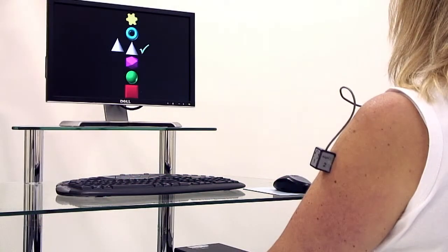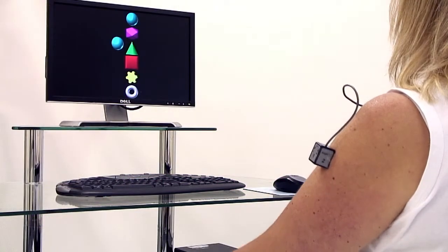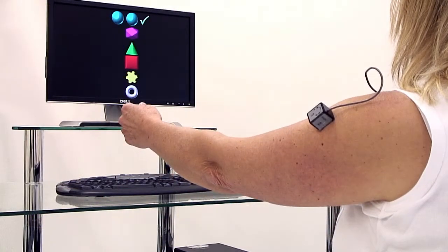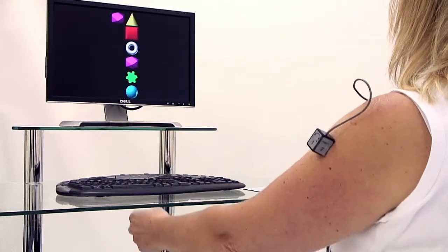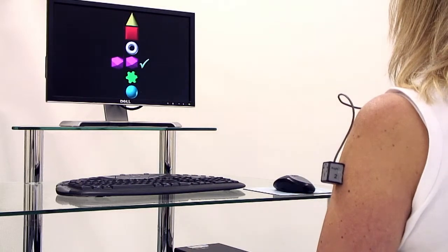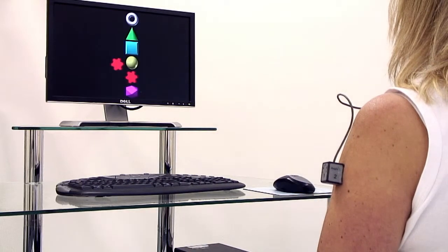And the large sensor is perfect for the larger movements of the wrist, elbow, shoulder, hips, knees and ankles.